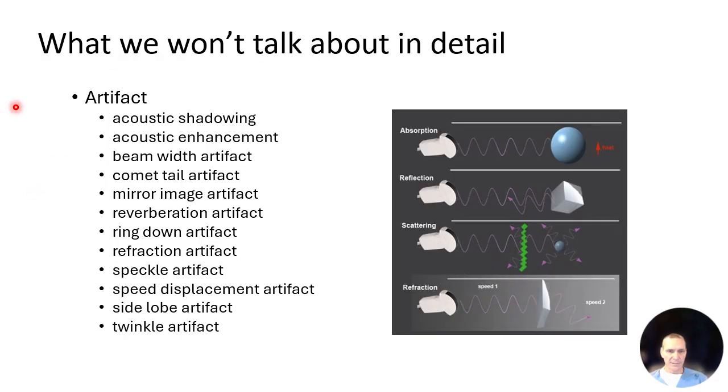I include this slide mainly to highlight all the different types of artifact that we have in ultrasound. So again, this lecture is the basics. It'll get you started, but this is not all-inclusive.